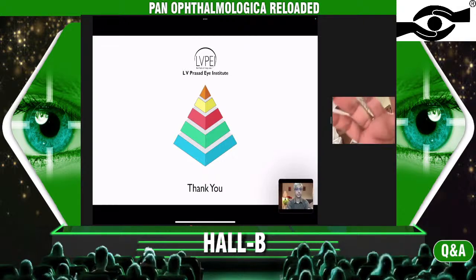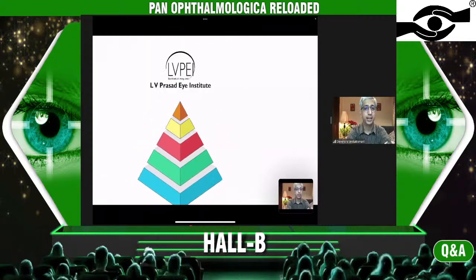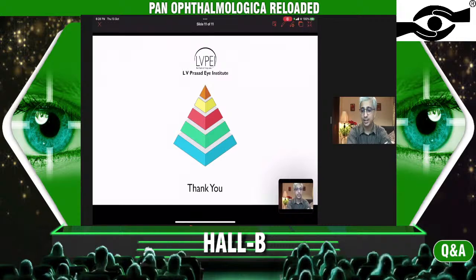Thank you. Thank you so much, Dr. Rajeev. Really lovely videos, and you simplified the topic by dividing it into its various steps very nicely. Just a few questions if you have time. Any role of, in your pre-operative assessment, when would you decide to use a belt buckle encerclage in these patients, or when would you avoid it?